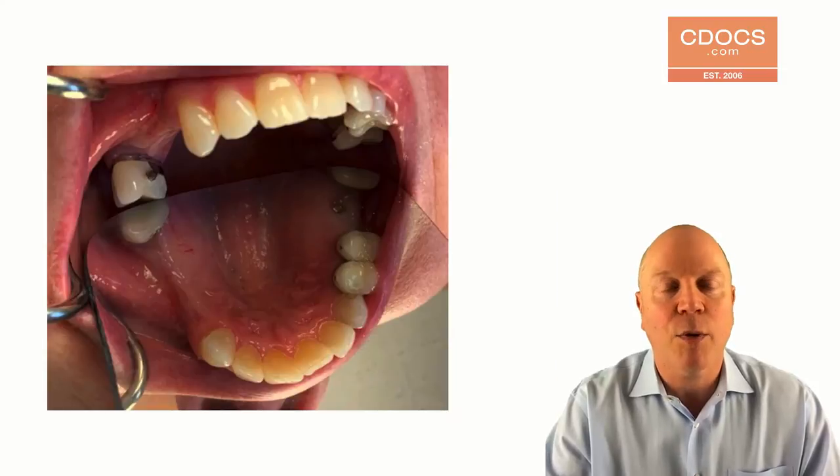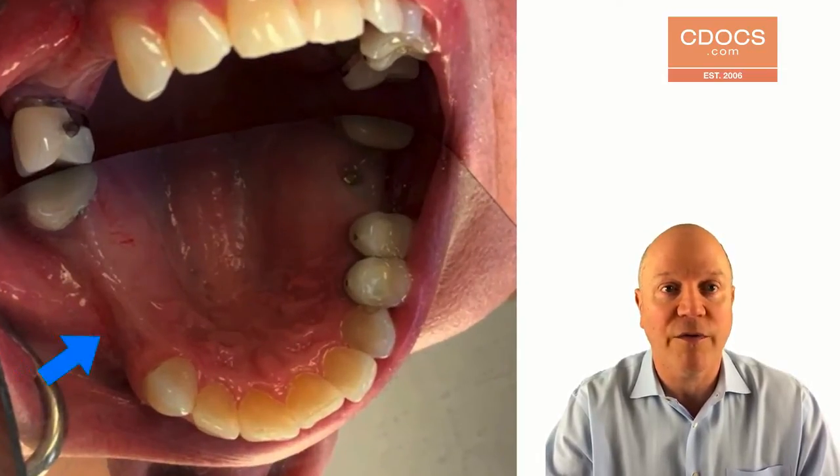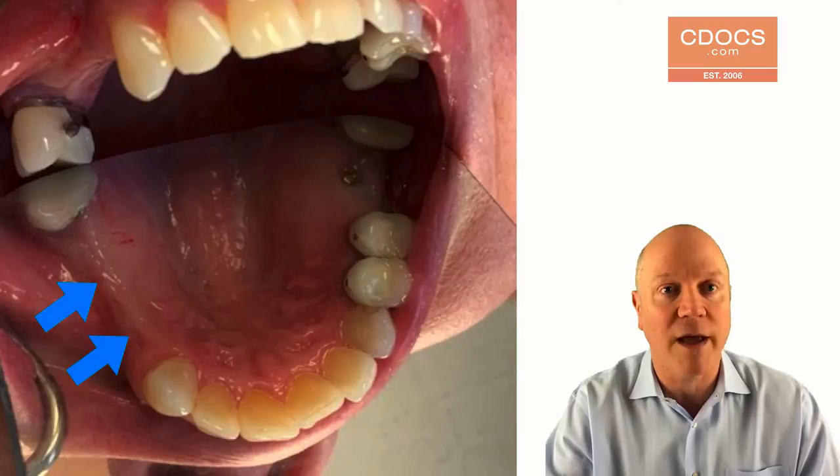The problem that we have here is I got primary closure and it did real well, but on the number five and number three areas, that keratinized gingiva is rather thin. So I'm going to have to take some from the crest, but where exactly do you go?